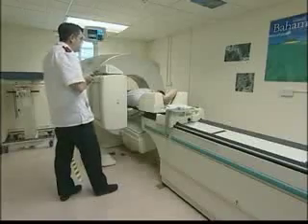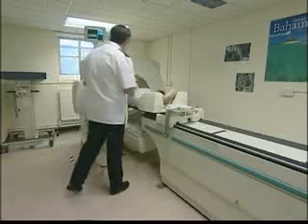In order to obtain tomographic images, two gamma cameras must be rotated around the patient as close as possible to the heart. The cameras are now trained to move around the patient as closely as possible without touching him. The computer will now calculate the rest of the orbit and teach this camera how to look at it.